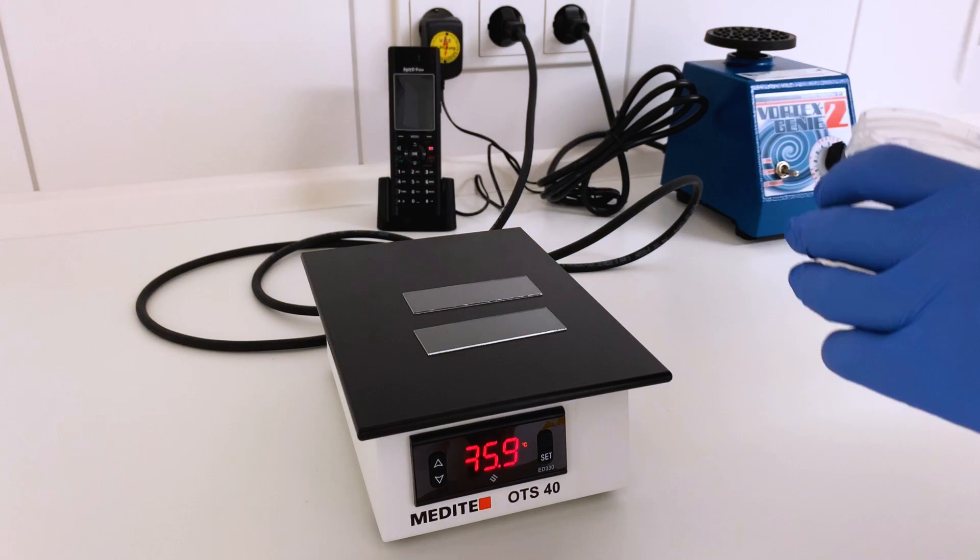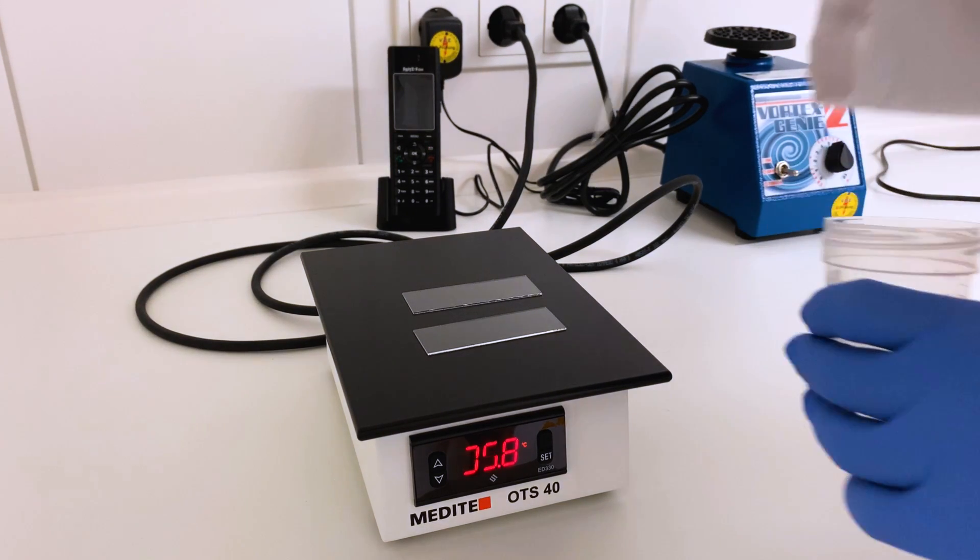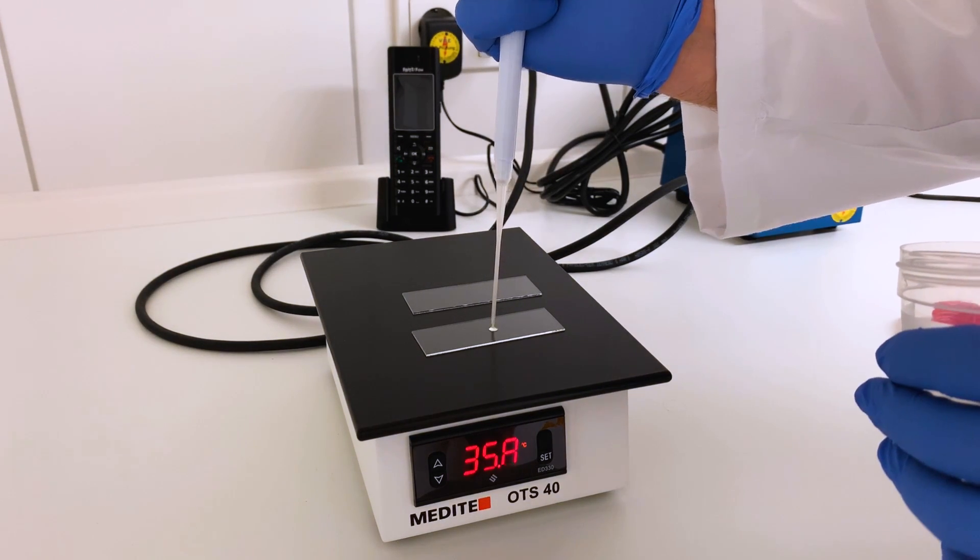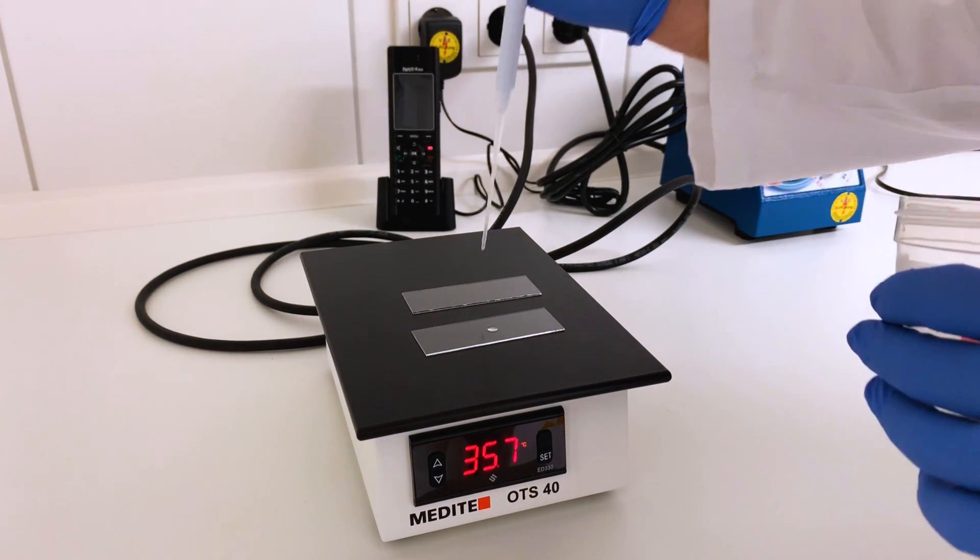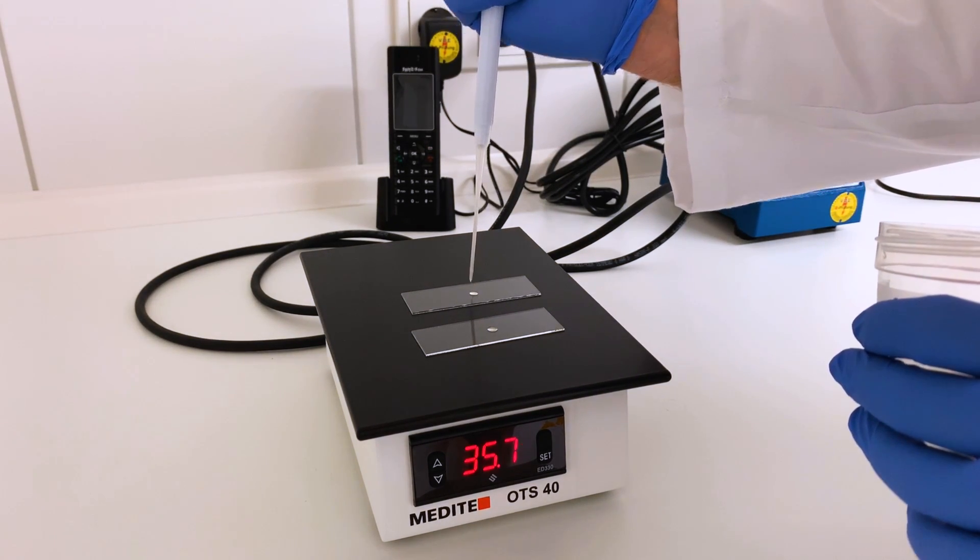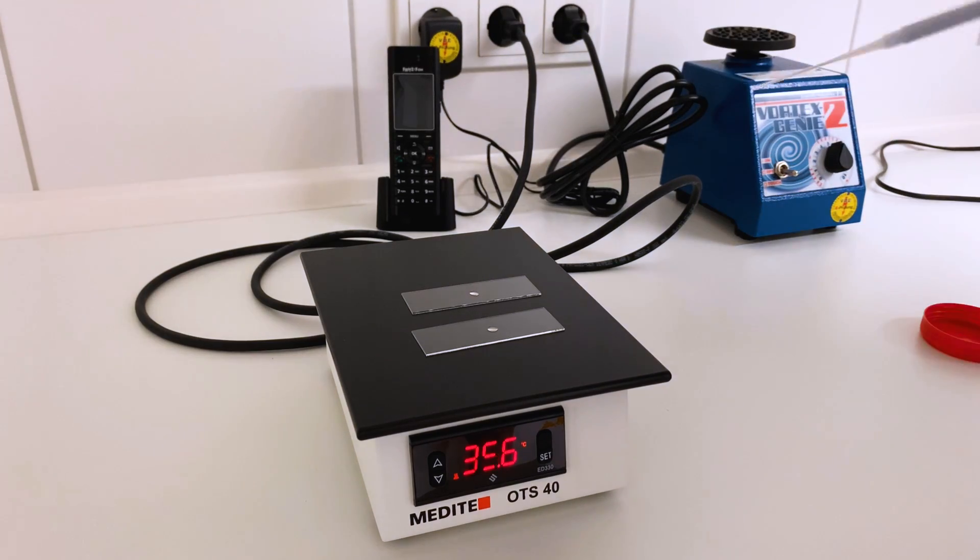For motility assessment it's even more important to have a warm environment therefore I'm keeping my slides on a heating plate. I'm putting 10 microliters of ejaculate onto the slides and then I can look at them under the microscope.